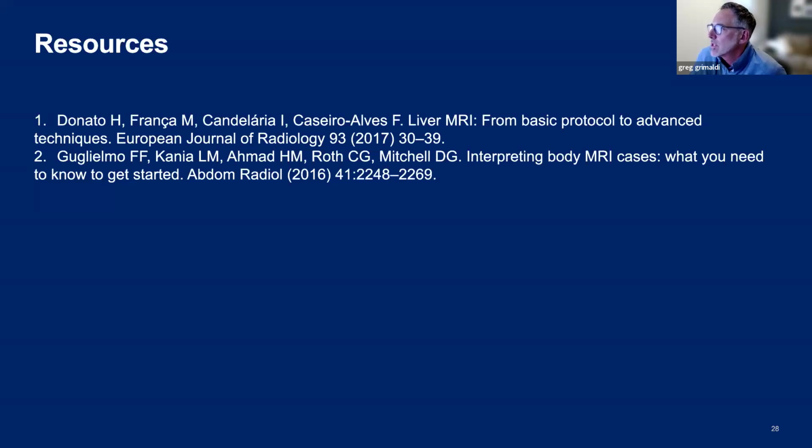One question, we see a lot of patients for restaging who are post-liver directed therapy with Y90. Can you comment on how to best assess post-treatment response versus an active lesion on MRI? Okay, so Y90 is actually very challenging. So we use Y90 for patients with HCC. We use Y90 for patients who have metastatic disease.